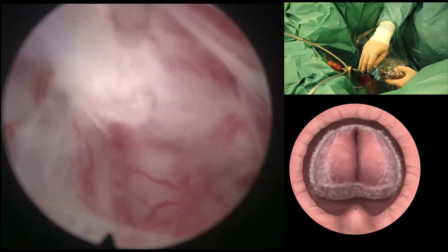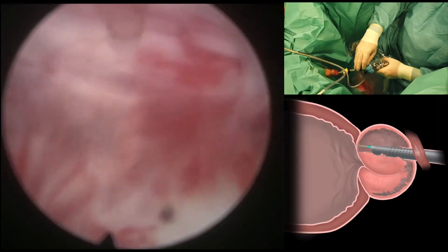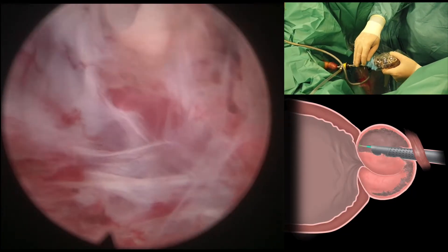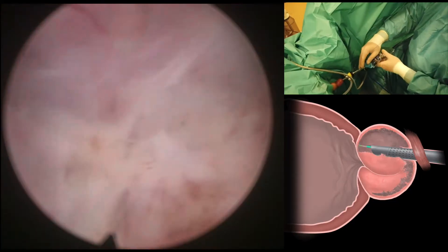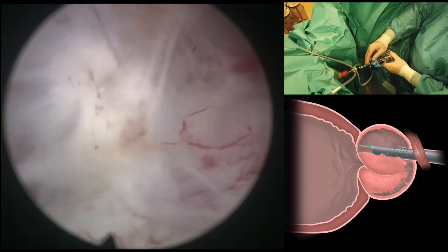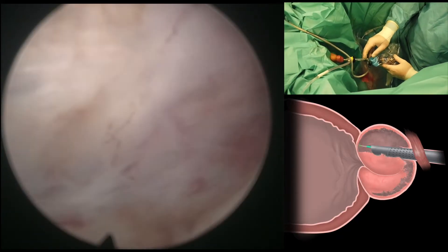This is the finalization of the early apical release. We believe that releasing the apex early in the operation helps protect the sphincter against traction and mechanical tear. This early apical dissection combined with an en bloc approach allows us to do a very fast and very safe operation, which I think improves the outcomes we would get with the three-lobe or the two-lobe classic techniques.